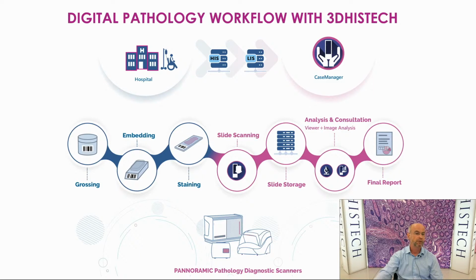Where previously, surely a lot of manual sample identification, sample retrieval, sample preparation was done, and mostly manually. But in recent years, we see the new automatic sample preparation systems where the barcodes already contributed to a significantly new level of specimen identification and the opportunity for slide scanning and as well patient-specific evaluation.